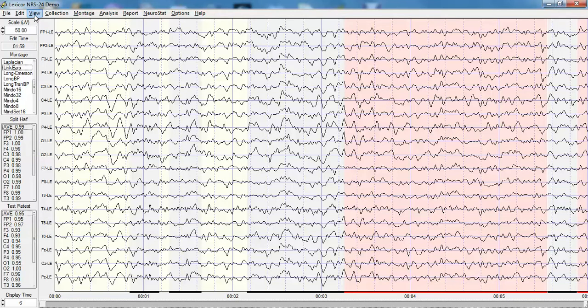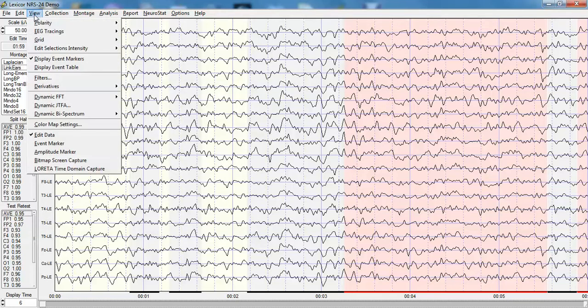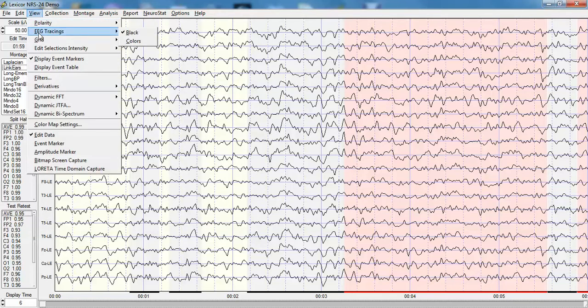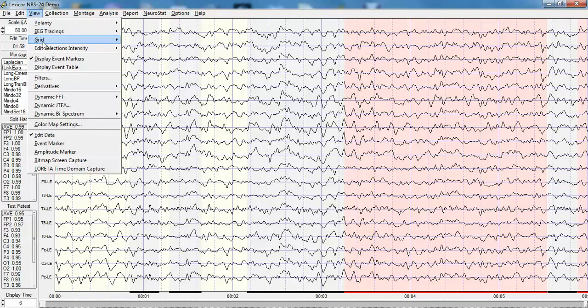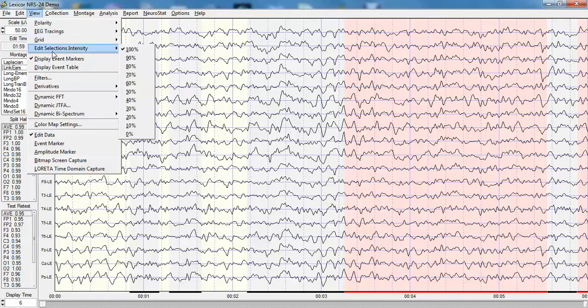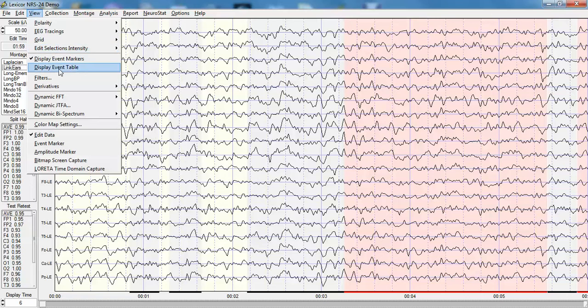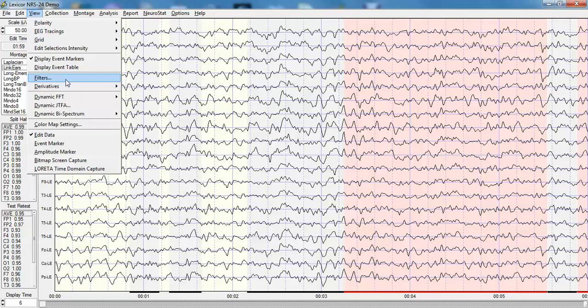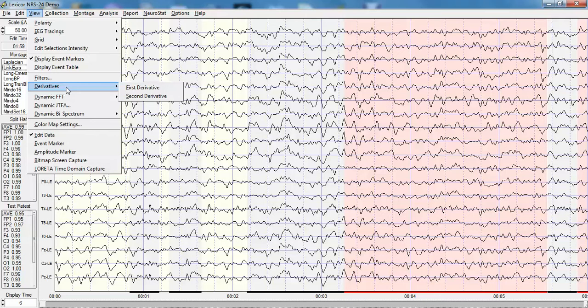In the view menu one can change the polarity of the traces positive up or down, change the colors of the traces, change the grid colors and intensity and even the intensity of the selections. One can also create event-related markers, open up event tables, and generate filters that will change the high and low pass filter settings as well as the first and second derivatives.